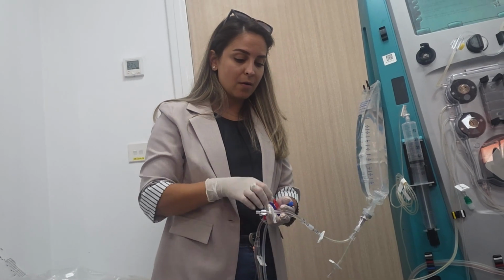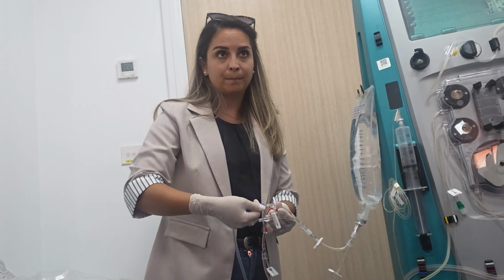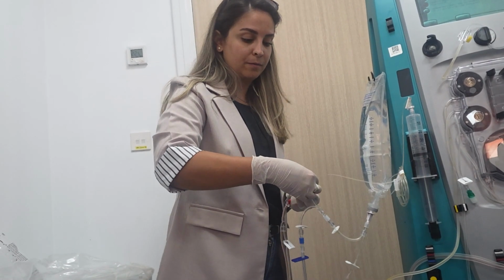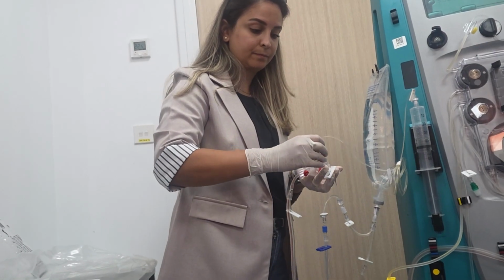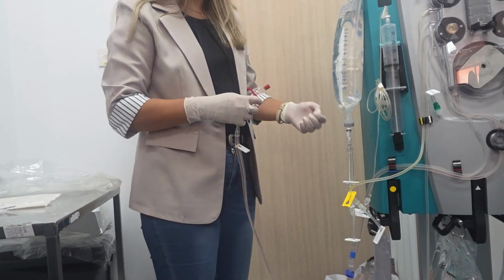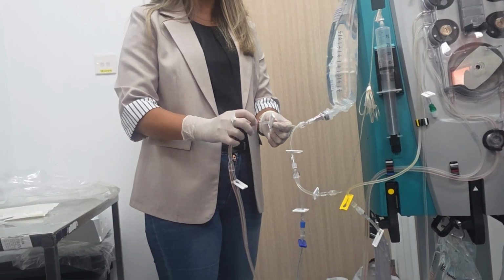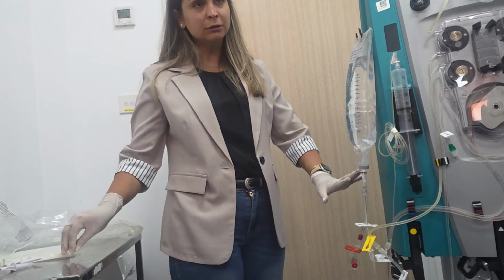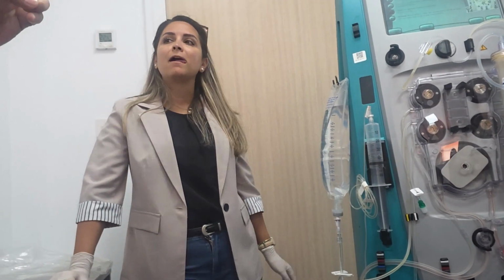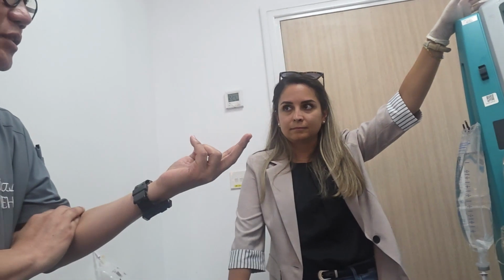Now, on one side of this Y line, I will connect the return, and the second line will be the calcium. Good, no confusion. Now the catheter red line is red. Red to red. Good. Can I ask something? Yes. Because this is also a practice here where they switch.